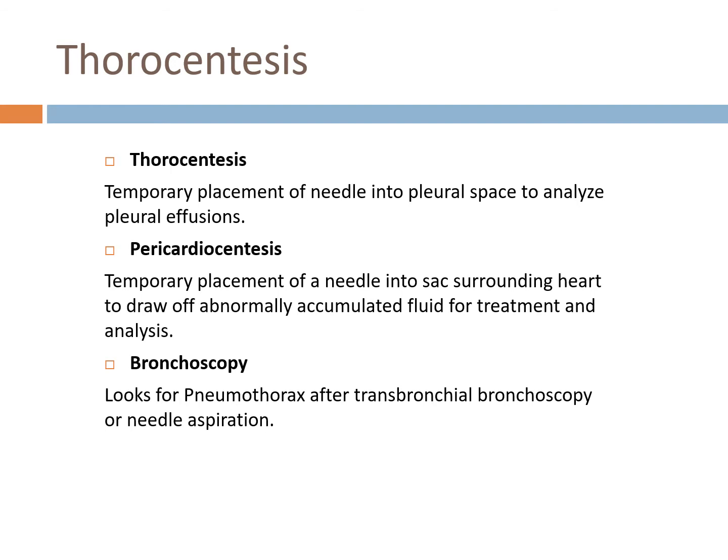And then a bronchoscopy is another way to approach. It looks for a pneumothorax afterward if you've had a transbronchial bronchoscopy or a needle aspiration.